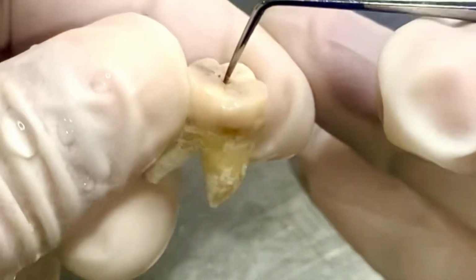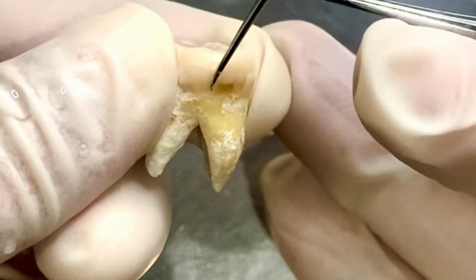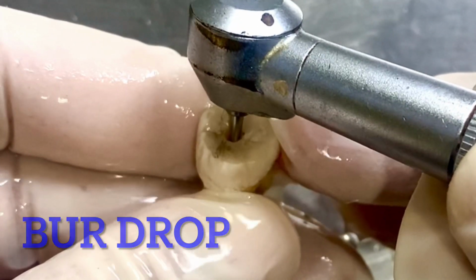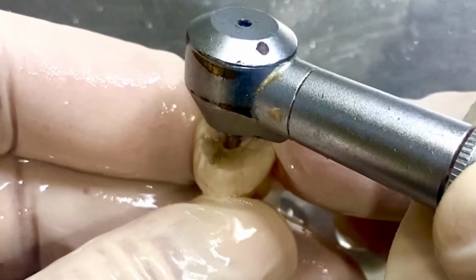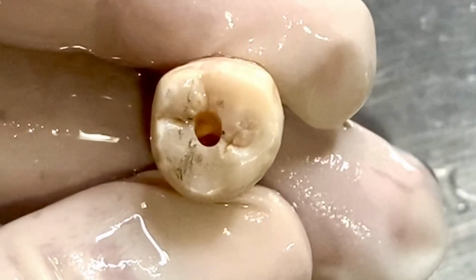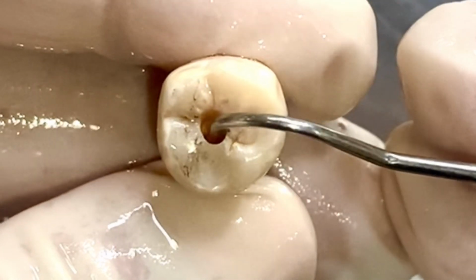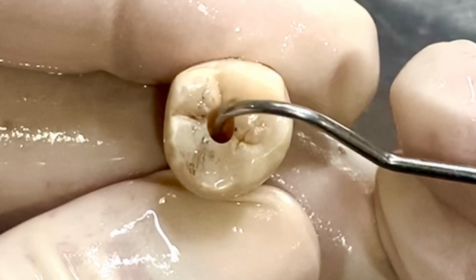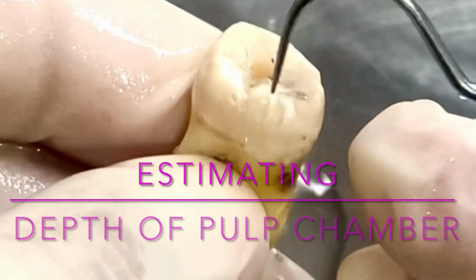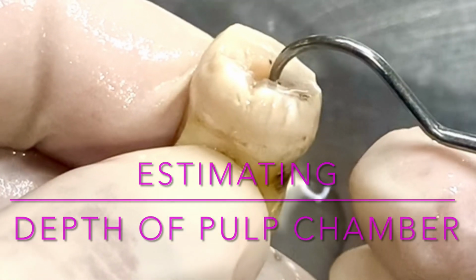I have made this initial notch, and now I will proceed with my burr in this direction towards the palatal canal. Now as I cut deeper, I can sense a burr drop. So I will stop. The pulp chamber is generally present at the level of cemento-enamel junction. That is what we observe here also.